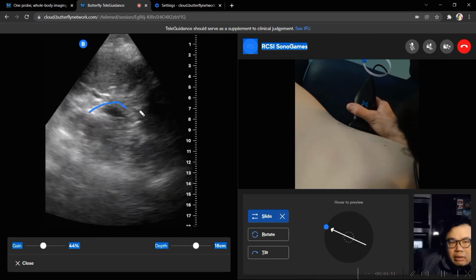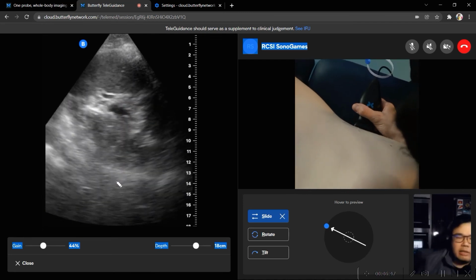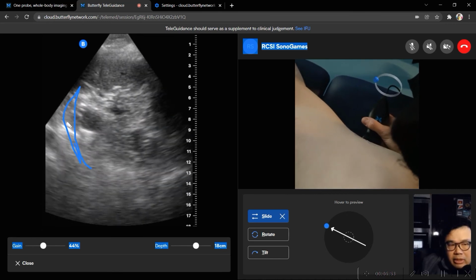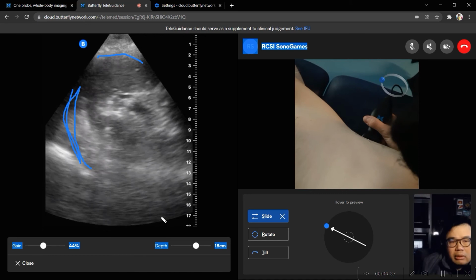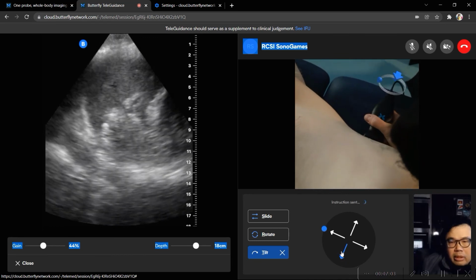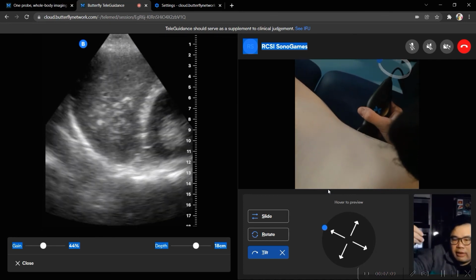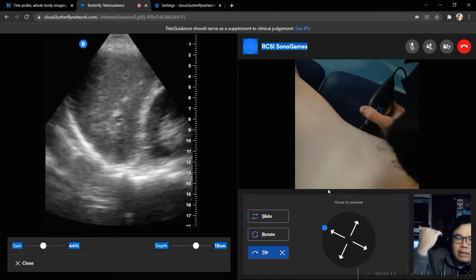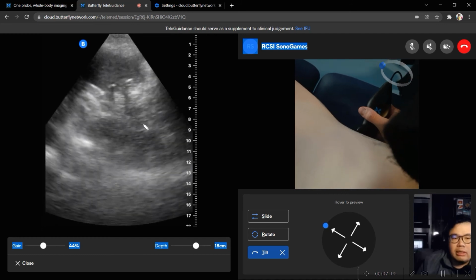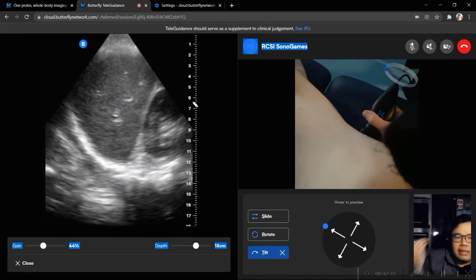The white stuff here? So that's probably all the vascular bed, I'd say. So that's like the splenic artery, splenic vein, and all that kind of stuff. But the area that you're particularly interested in is over here and over here. And if you tilt the probe tail up a small bit, you start to see the kidney. Oh, kidney. That's perfect. Exactly. If you tilt the probe too far tail down, because you're insinuating anteriorly, you're going to see stomach, and the vessels, which is what you saw earlier on. That's when you tilt very anterior, and then if you tilt more tail up, you start to see this.